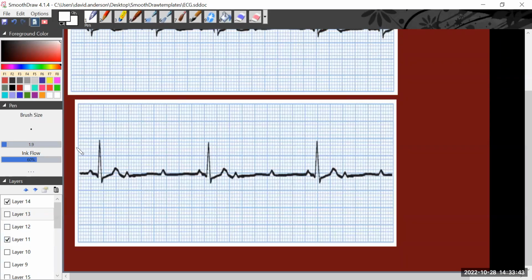So here we are here. In this drawing, in this ECG, we see down here a normal cycle, and then we see a missed QRS, another missed QRS, normal. So again, this individual will be pumping blood, but the overall cardiac output is going to be severely affected. Instead of seeing a QRS every 4 squares, we can see that we're going between 1, 2, 3, 4, 5, 6, 7, 8. We're missing 2 complete beats in between. And again, 2 complete beats with irregular patterning, irregular non-conducted P waves.